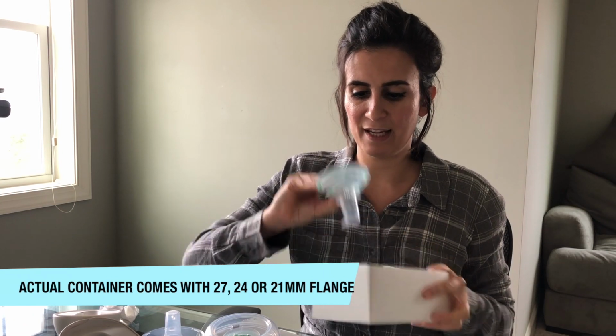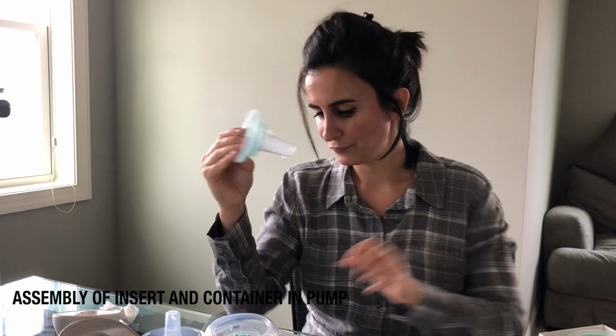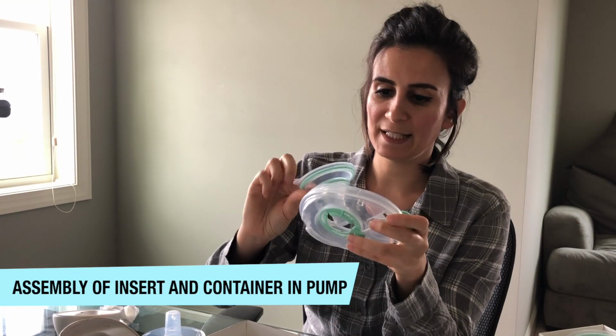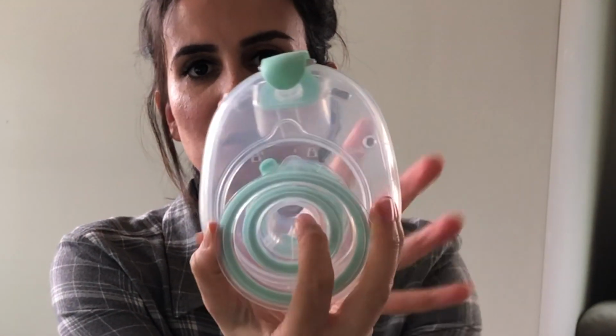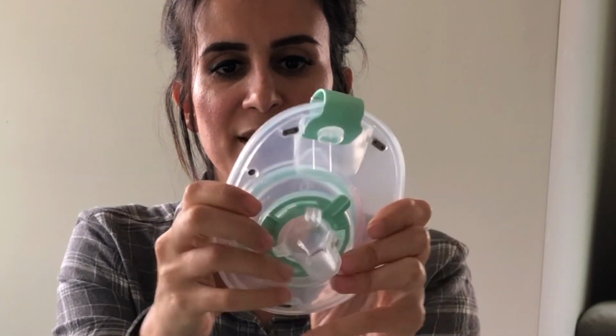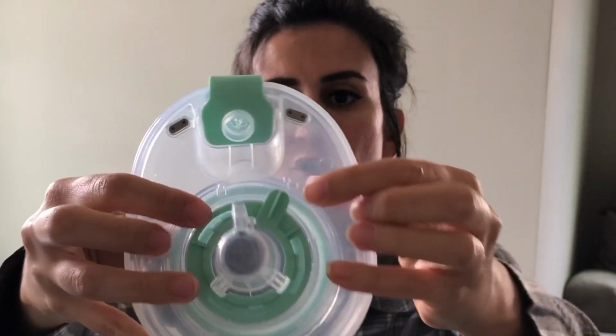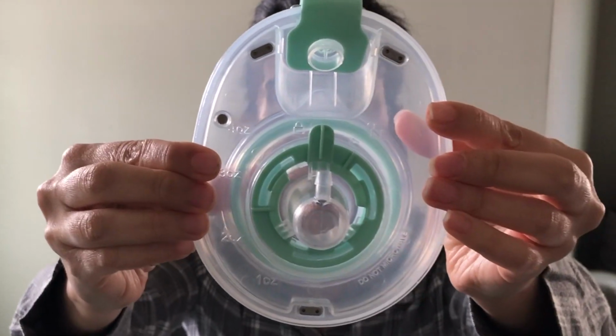And you have the actual insert. 2 inserts, obviously. So the way you place this in is you're gonna want this top piece to go right there. So you go in, you click it in place, you push it in, okay? And then you want to make sure you go from the unlock to the lock, just like that. As simple as that, guys.